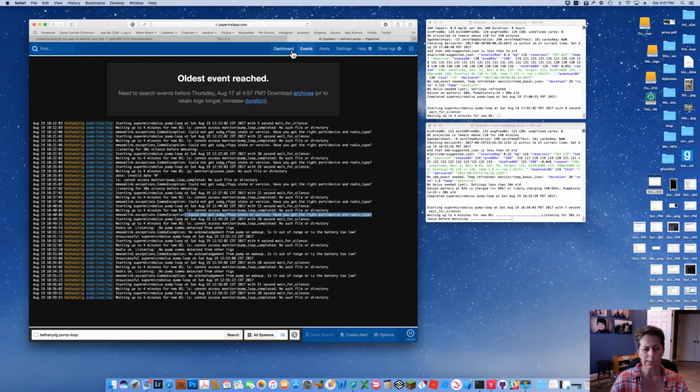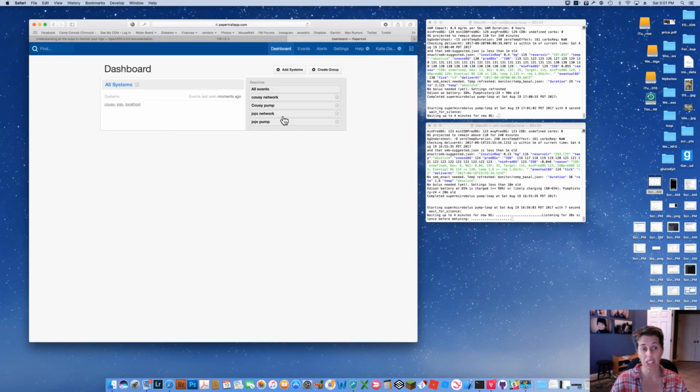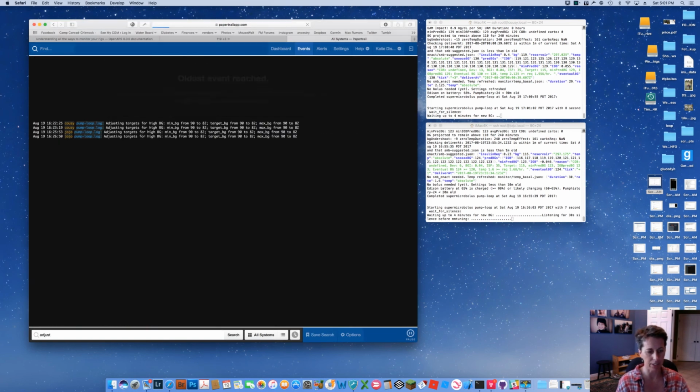Which one do I want to go to? But those are the important ones. I think that's good. Save your filter searches. Oh, one of the other ones I like to do. Let's go back, actually. That's a good one. Let's go back to adjust as a filter.